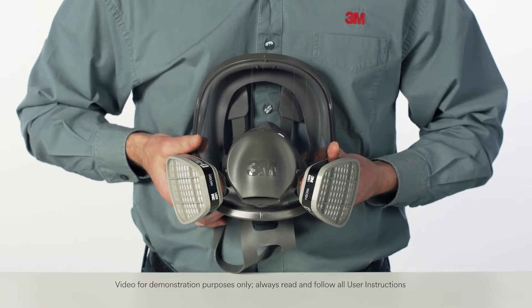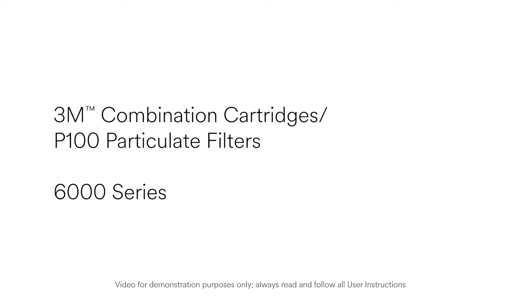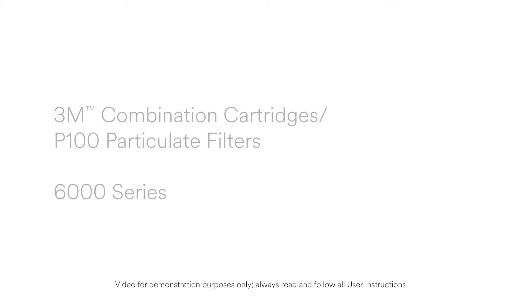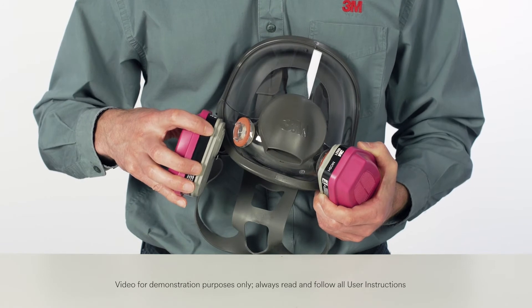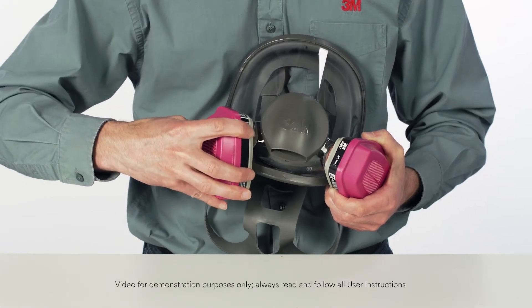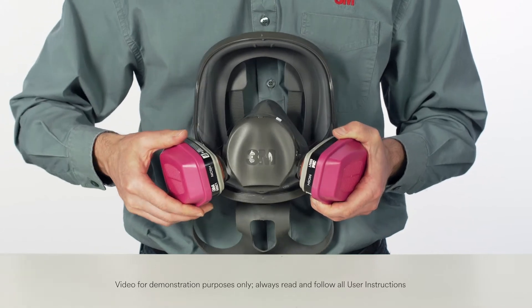In some work environments, both a gas vapor cartridge and a particulate filter are required. To attach the 3M combination cartridges P100 Particulate Filters 6000 Series, simply align the mark on the cartridge with the small bayonet lug on the facepiece and push together. Rotate the cartridge clockwise one quarter turn to stop.